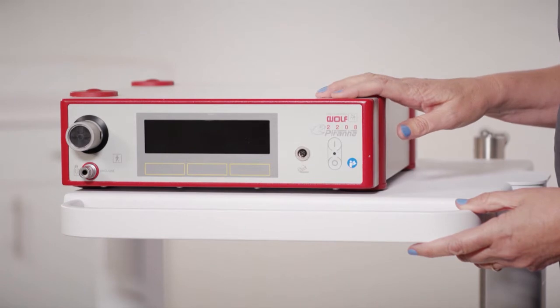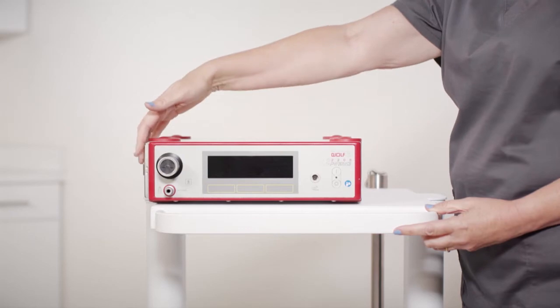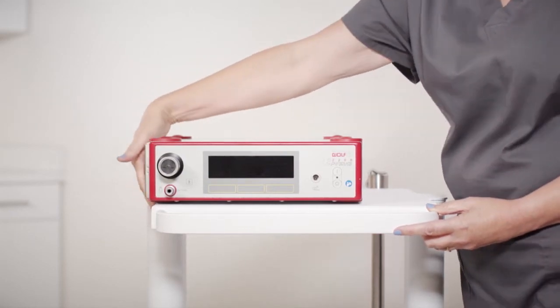For the assembly of the Piranha units, place the suction pump unit on a flat surface or cart. Place the retaining plate side on an open edge of the cart.